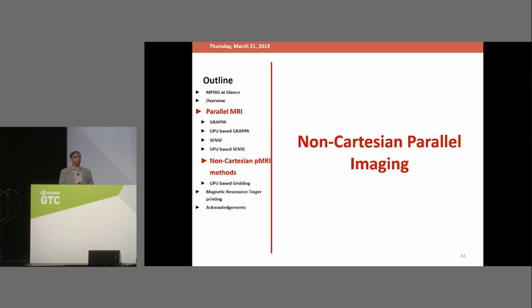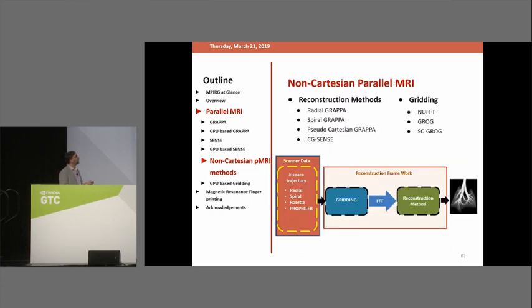The third thing I want to show is non-Cartesian parallel imaging. As I said, previously it was difficult to use non-Cartesian imaging, and a professor used to say that the purpose of non-Cartesian trajectories is only to produce PhDs. It's of no significance in the industry. But with the better utilization of electronics these days and better performance of electronic systems and amplifiers, it's more and more used now.